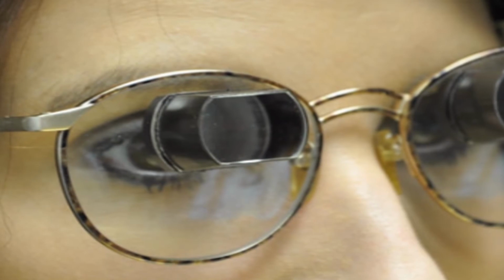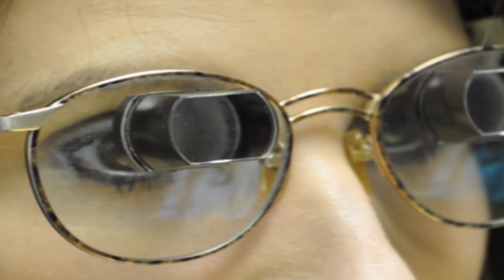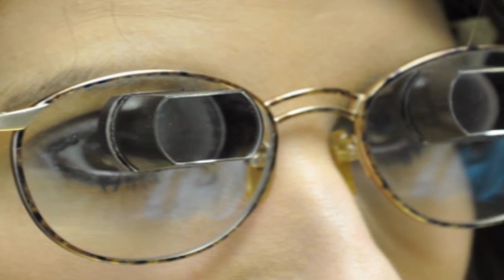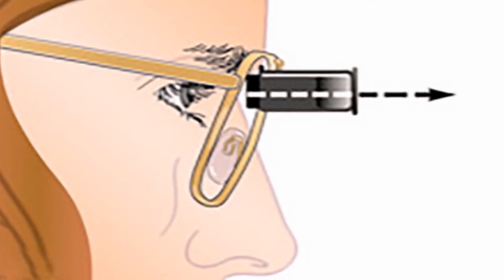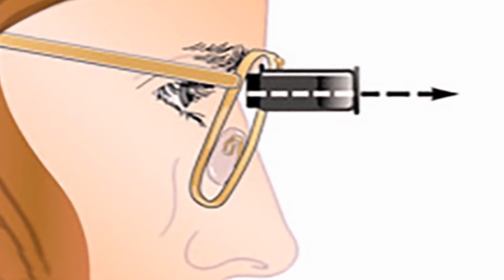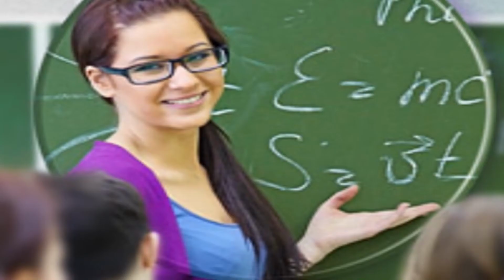This bioptical system allows the user to rapidly switch between a normal view and a magnified view without ever using his or her hands. A person with low vision can also use bioptics in the same situations he or she might use a handheld telescope, such as seeing a classroom blackboard.